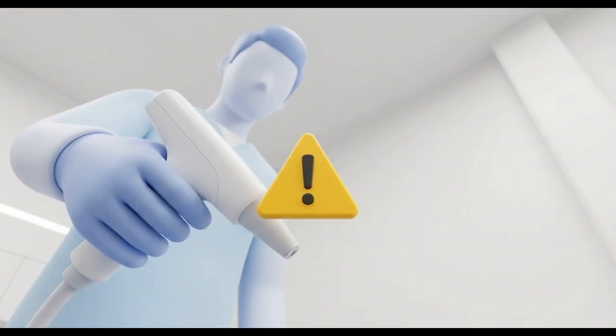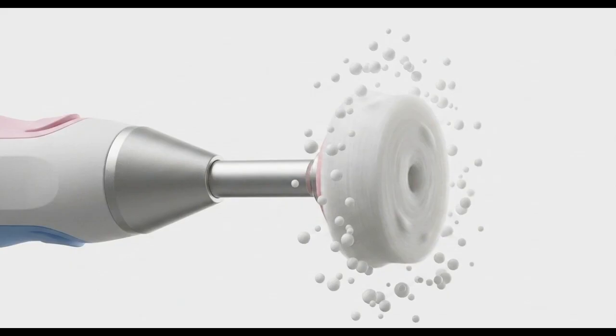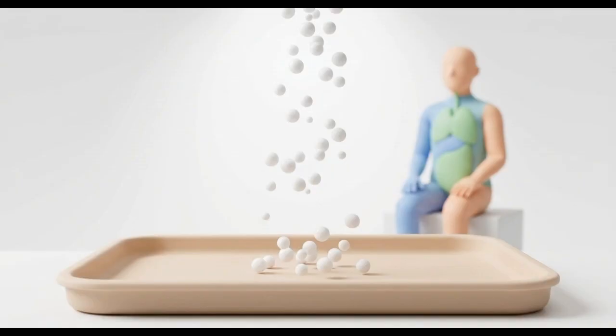Pay close attention to this safety warning. Before turning the unit on, point the device completely away from the patient. Then press and hold the power button for 2 seconds to start the rotation. The spinning sponge will throw off excess cleanser upon startup. Strictly adhering to this directional startup protocol prevents accidental chemical spatter in the patient's eyes.